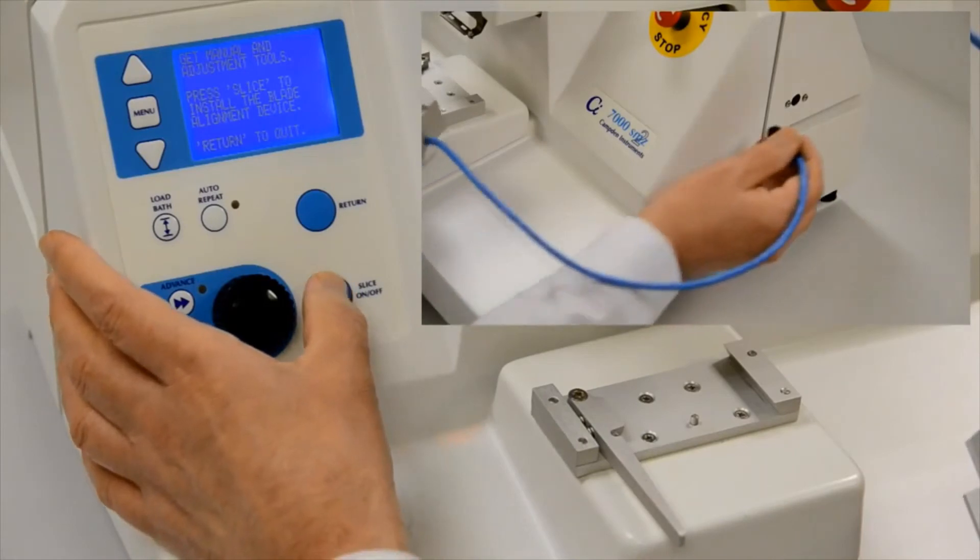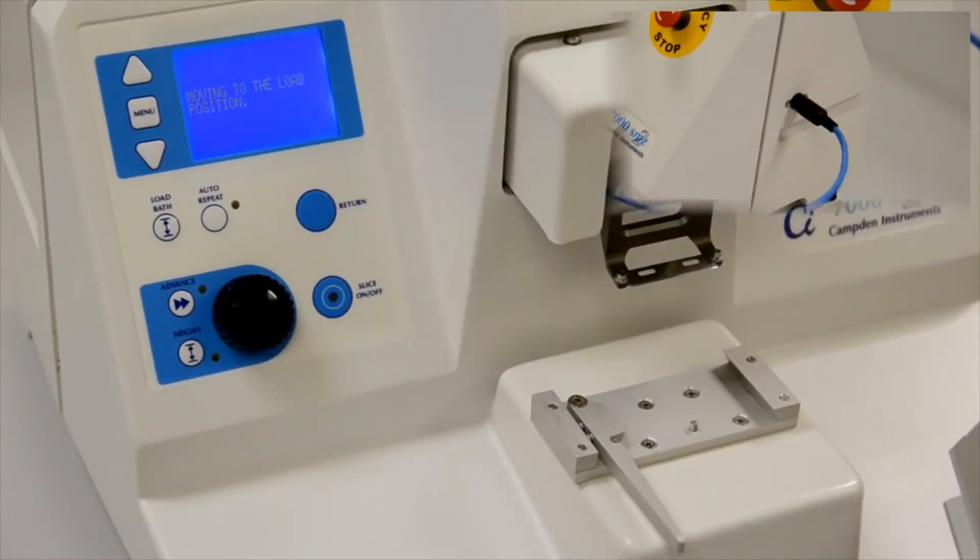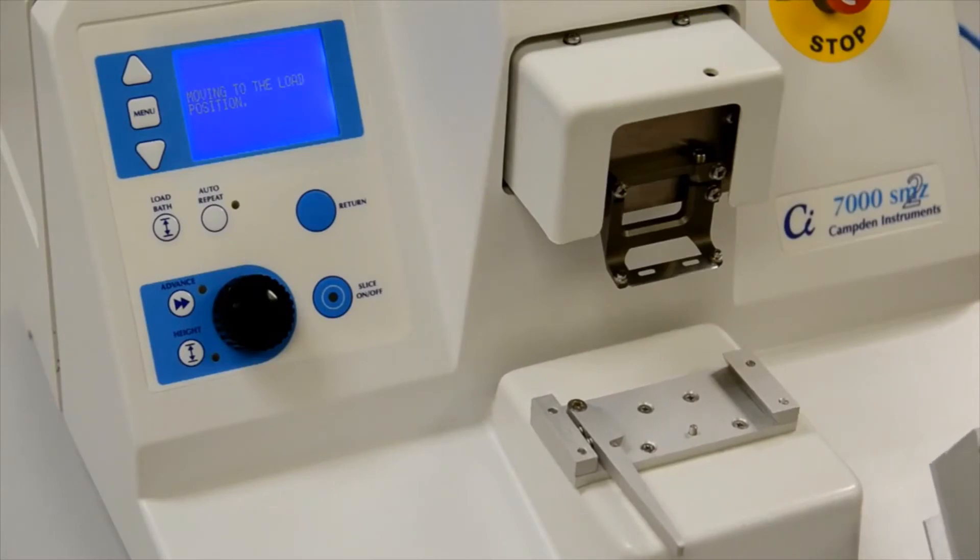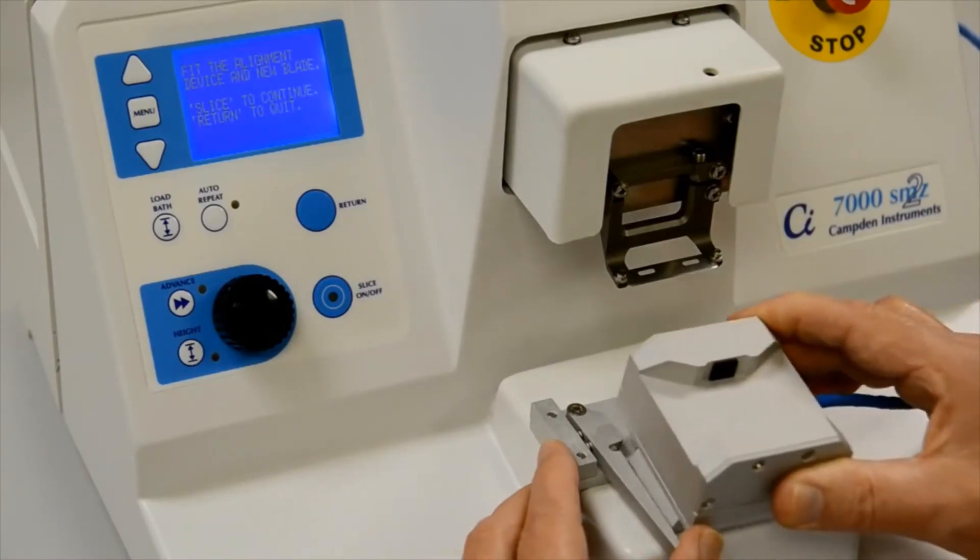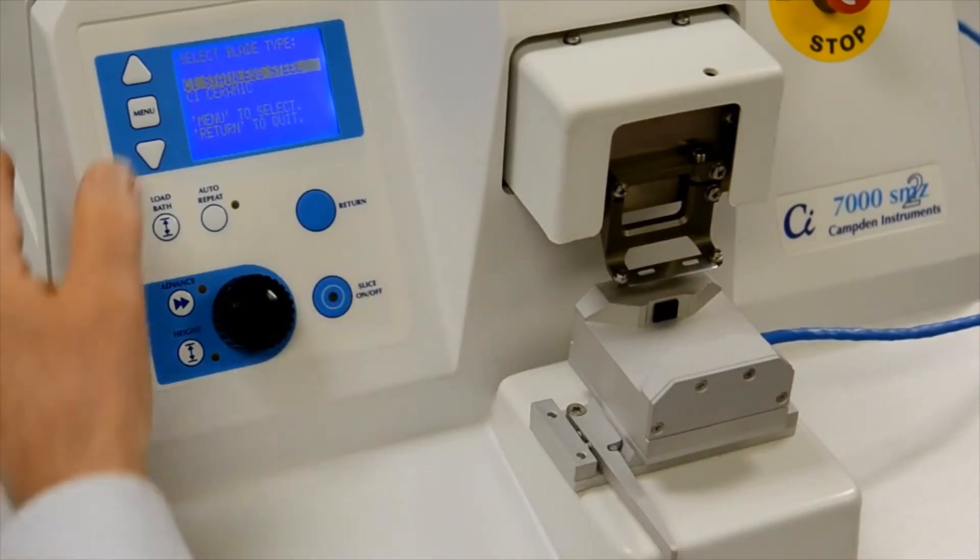Connect the Opti-Cal unit. Once you have done this, the instrument will reposition the vertical stage and ask you to fit the Opti-Cal unit to the stage. Confirm that it has been fitted and confirm the type of blade.